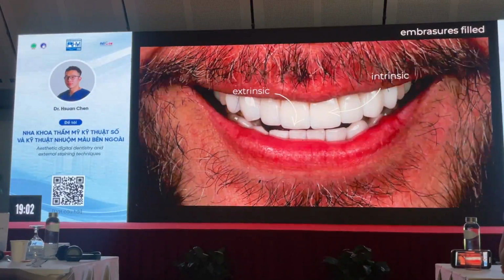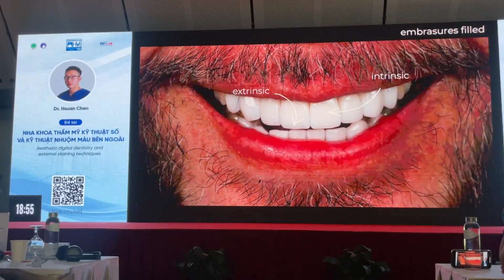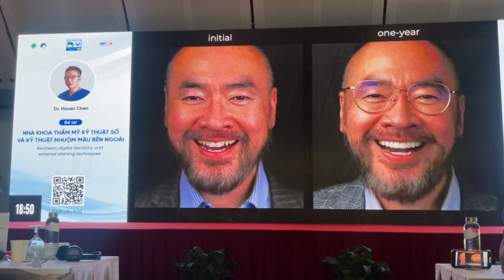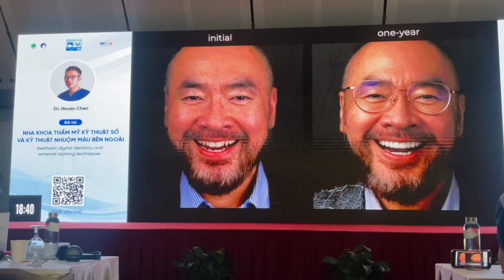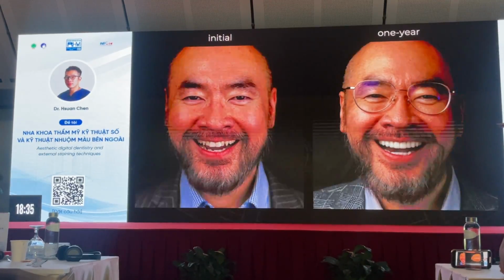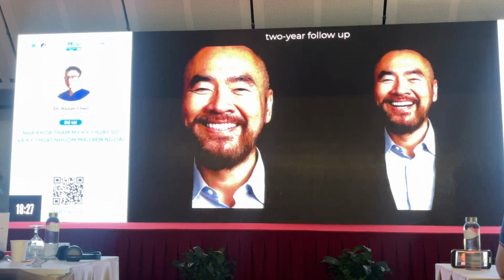Okay? And I want to bring your attention also to tooth number 22. With the proper thickness control, the ceramics will look the same color. Okay, so this is before, and this is after. And like I said before, the way we can tell somebody's teeth are crooked is not because their individual teeth are moving out of alignment. Nobody cares about that. When we look at a person, it's the outline of the teeth, right? So look at the bottom teeth, where there's a step. That's the thing that we notice. So when we do treatments, we make sure to fix that as a first priority.